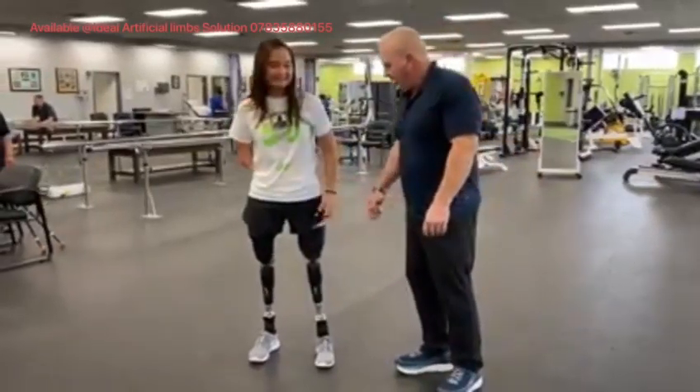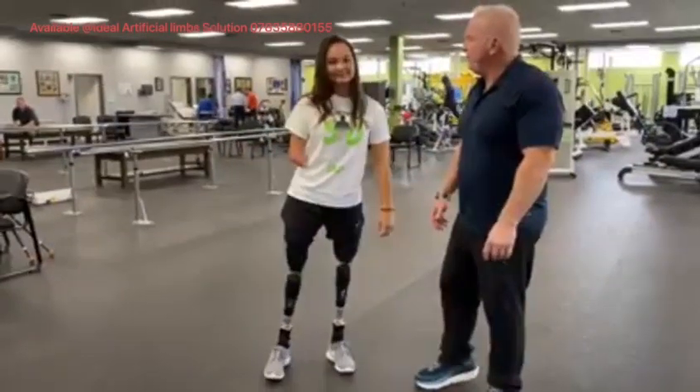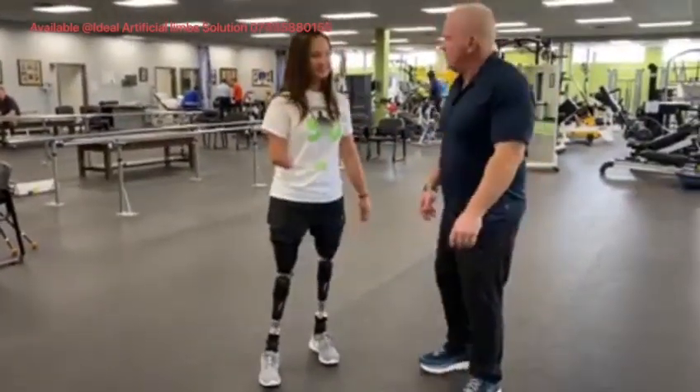This is Ryan. She's wearing the bilateral PPS system. Ryan, you've been in it for how long now? Since June of last year, so quite some time.